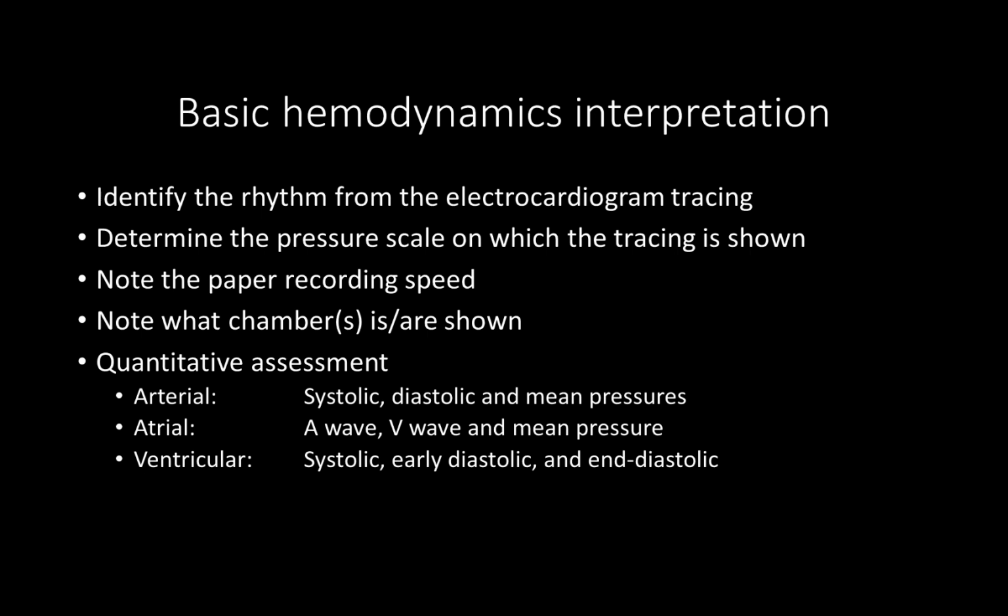Perform quantitative assessment. This will depend on which chamber you're in. For arterial chambers, note the systolic, diastolic, and mean pressures. For atrial chambers, note the A and V wave, and also the mean. For ventricular chambers, note the systolic, early diastolic, and end diastolic pressures.